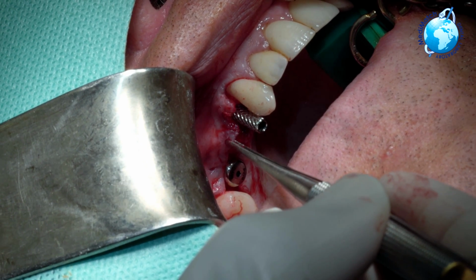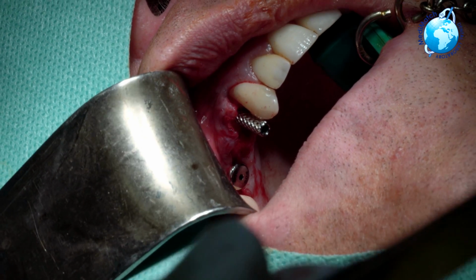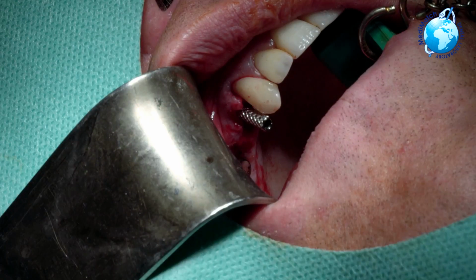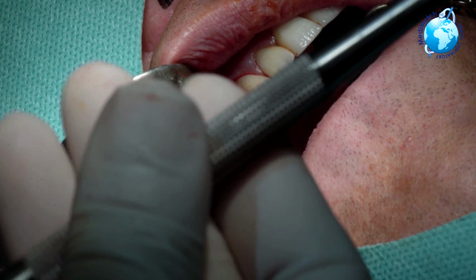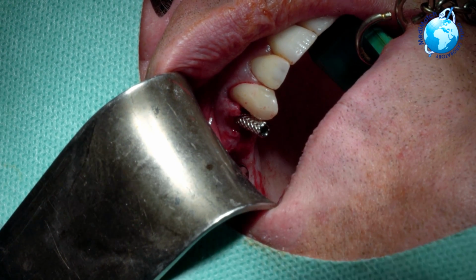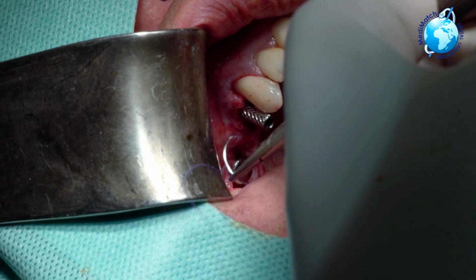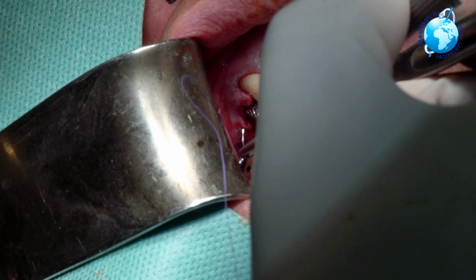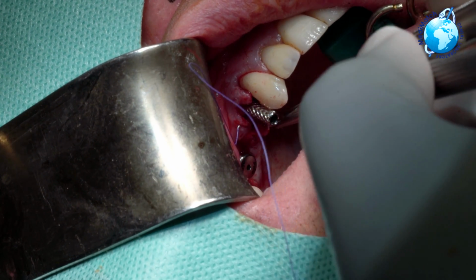Perma-sharp, yeah, Perma-sharp 5.0. Right, and we're just stitching up now. Here we have a closed loop suture holder using a 5.0 Perma-sharp. It's a nice antibacterial suture, nice and small. And we're just being gentle to the tissues, bringing them back in. Is that through on the palatal? Confirm.